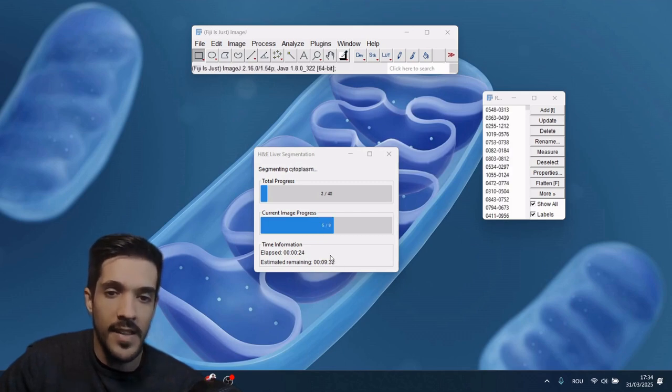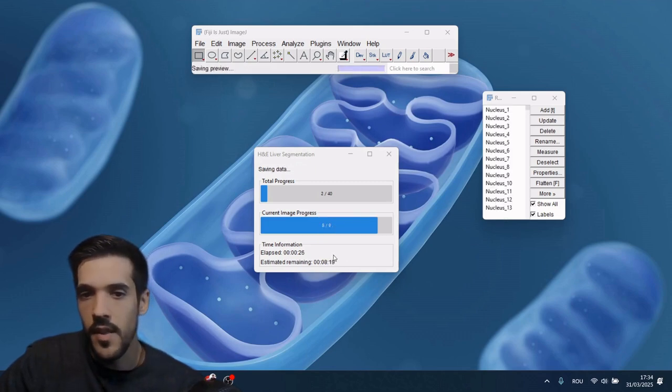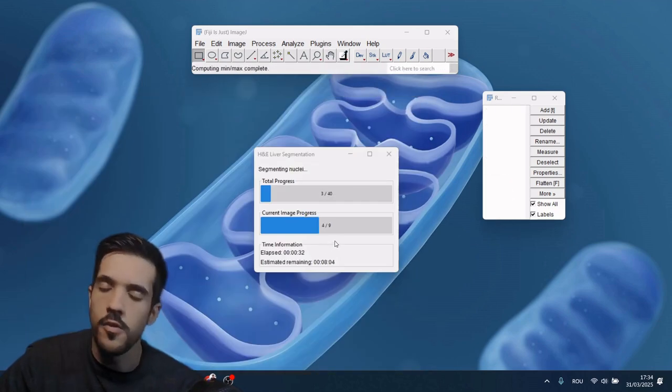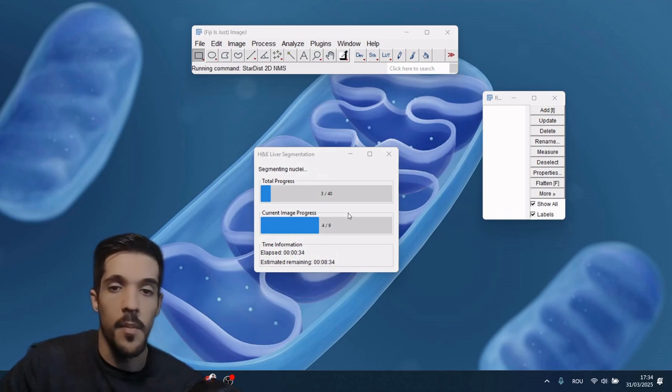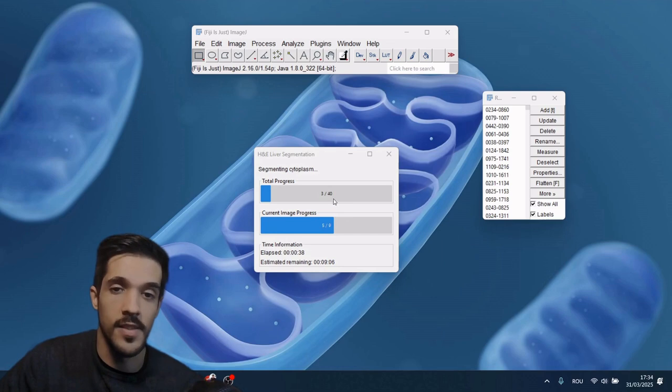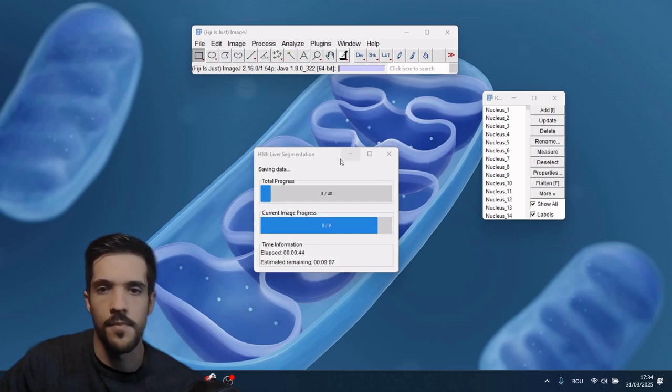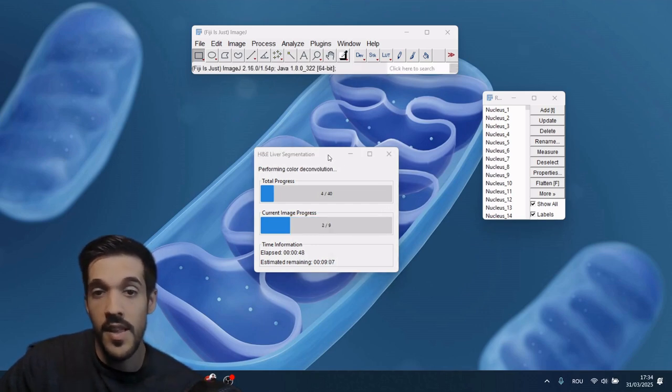For the analysis, I found out that it really depends not only on the number of cells in the image, but also on the number of total pixels. Also, since the image gets converted to a TIFF at the start of the plugin, the compression does not matter.